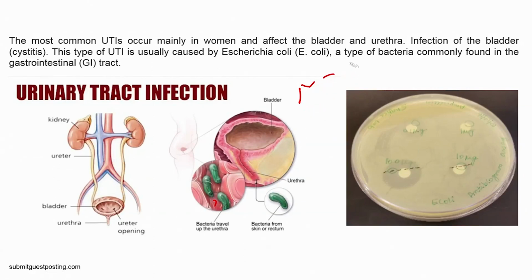Alright. So, the point is, this is how it is done. You can see here very clearly the effect of the disc diffusion technique, and everywhere there is a bacteria, which is your E. coli, alright.